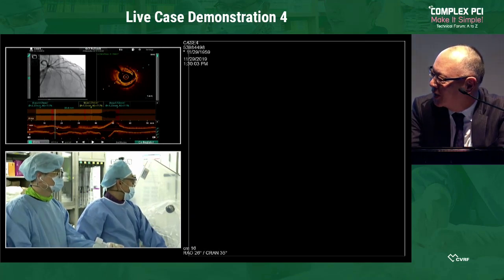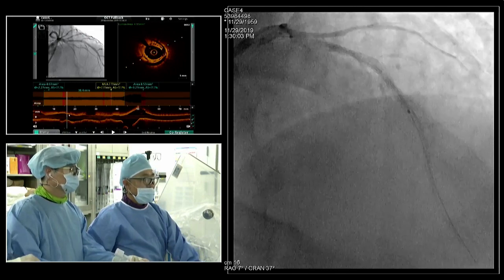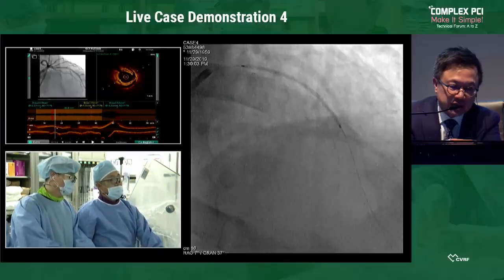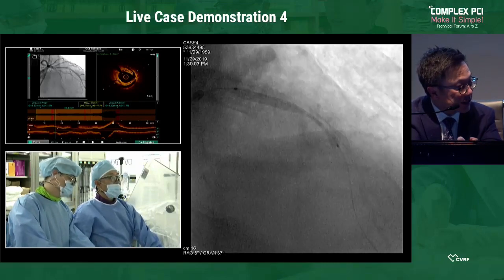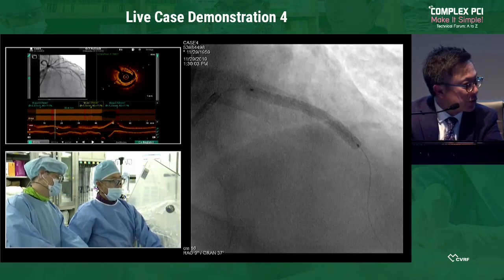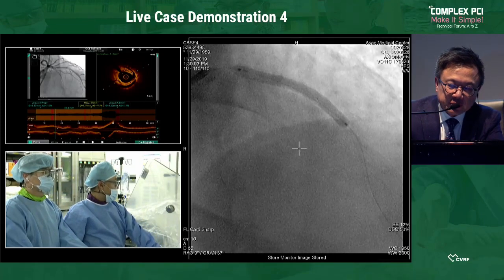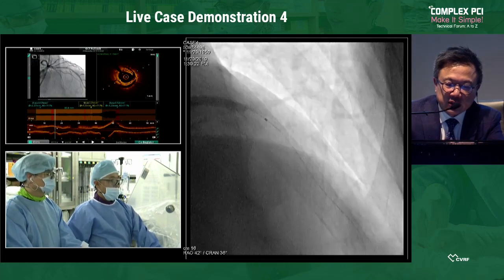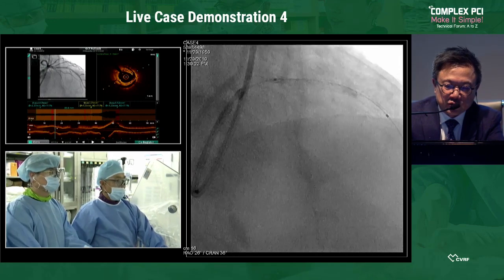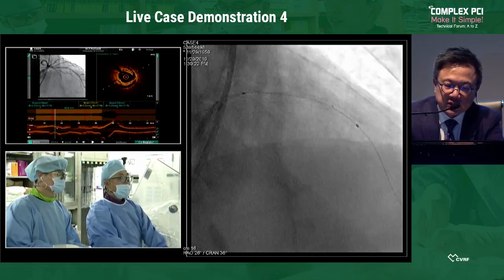The difficulty is that you don't know, as the polymer struts go away, whether even when there's no negative remodeling at this time, 6 months later, there would be negative remodeling. So you're safer to put in just a metallic backbone to hold it up. And this is a pretty big vessel proximally, so I think it would do well with another DES in there. And I think you chose using the same stent, so you match up the drugs, everolimus, anyway.